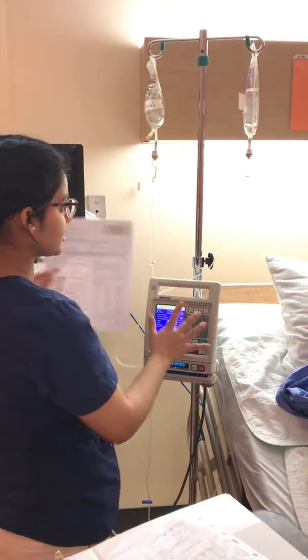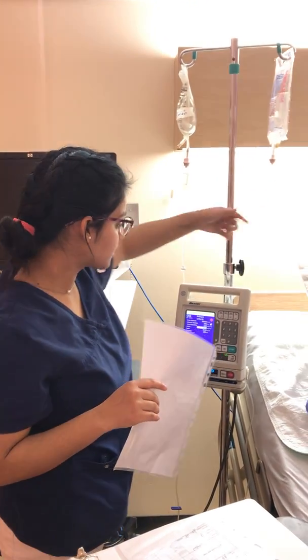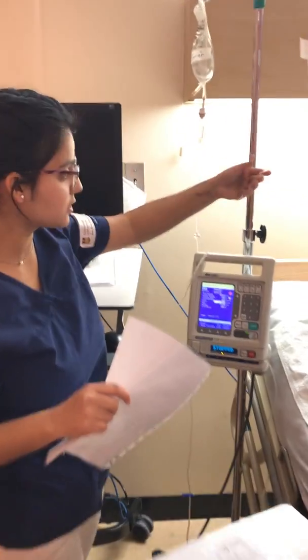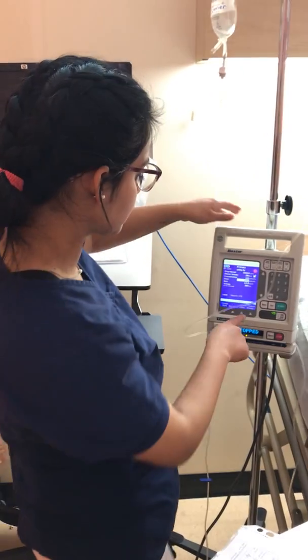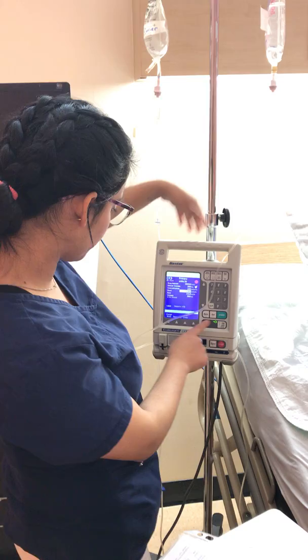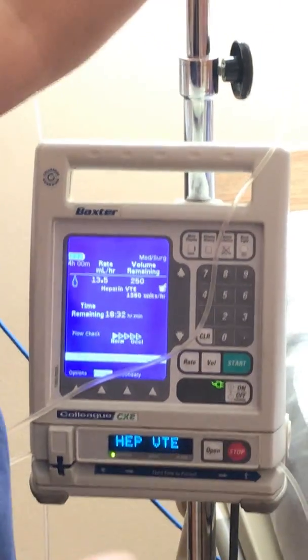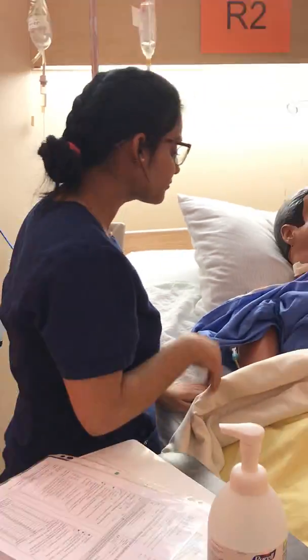So everything matches. My buddy nurse has already checked that it's the right bag with the right label, and it's the right kind of tubing, the tubing without any ports. We don't want any ports, so this doesn't have any ports, so that is good, and it's connected to my patient. So now I'm going to start. And I can see my 3 drips.